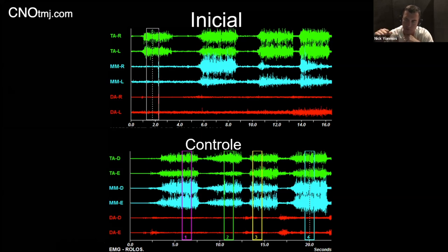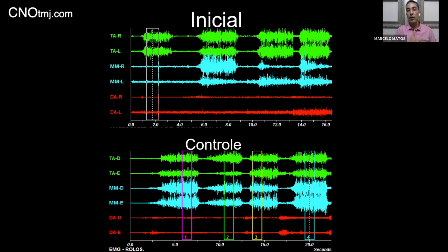Also, you should make it clear, about the orthotics you mentioned that were anatomic, there are times where the orthotic is going to be much taller on one side than the other. For sure, with asymmetrical faces because of asymmetry of the joints. You're going to have orthotics that are completely asymmetrical. And there are going to be times you have to update it. Periodically, you may have to check the data again, and make a new one or overlay.